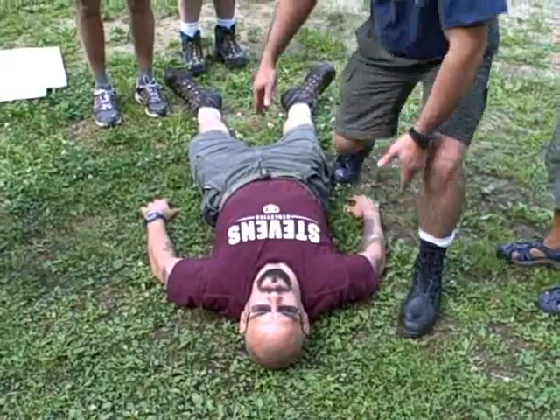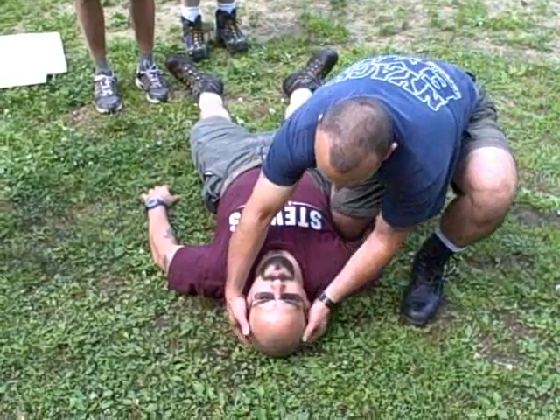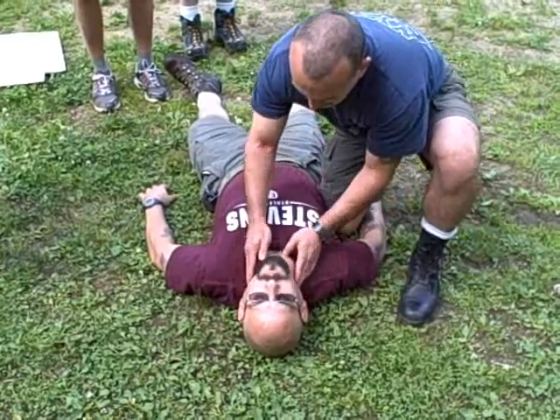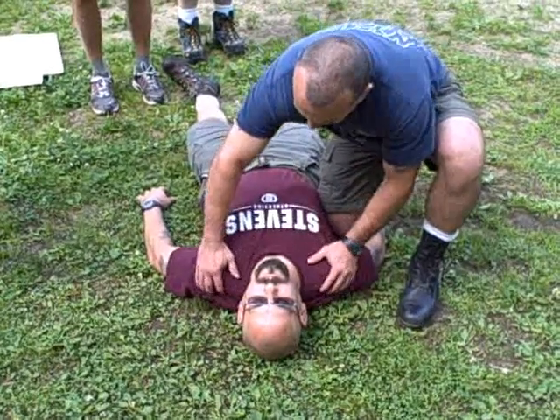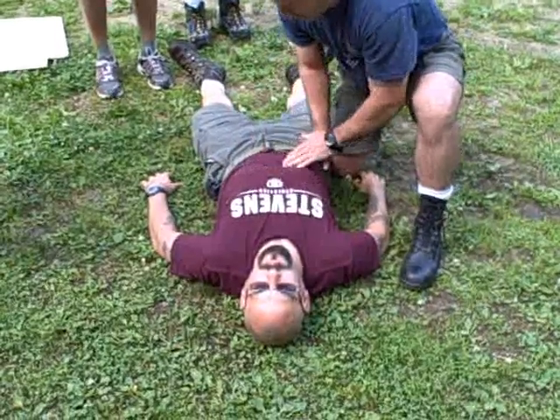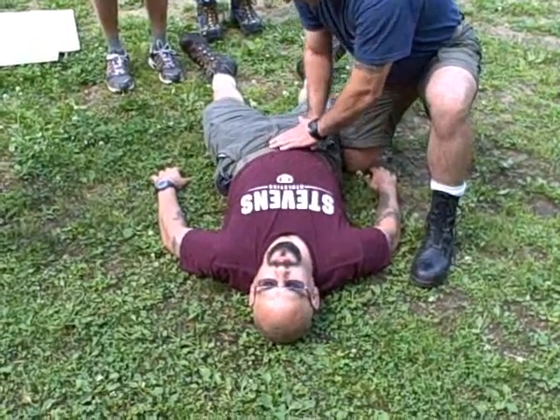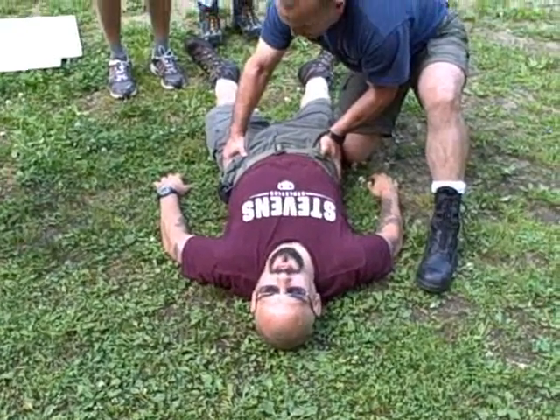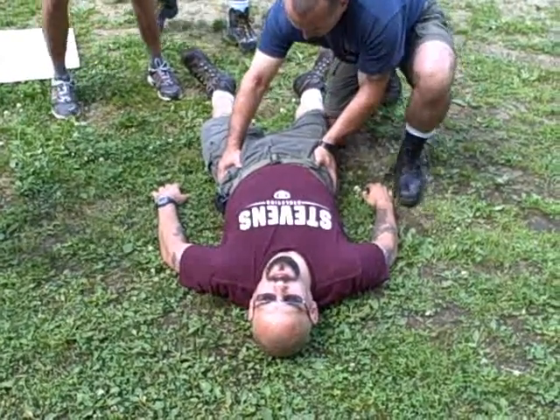Ivan's going to start with a quick patient exam, working from the head down. He's just checking the head — everything's nice and stable. The neck is stable. He's checking the clavicles and shoulders. Chest is nice and stable. Belly's nice and soft. He gets down to the pelvis, squeezed it and it shifted. It closed — it was an open book fracture and it's now closed.